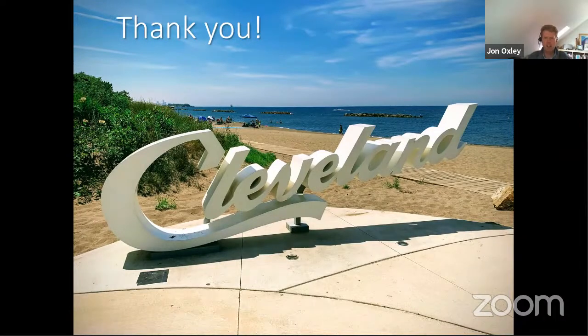So here's a staging question, combining two of these questions together. How do you stage tumors with leiomyomatous stroma in which the stroma is extending into the fat?